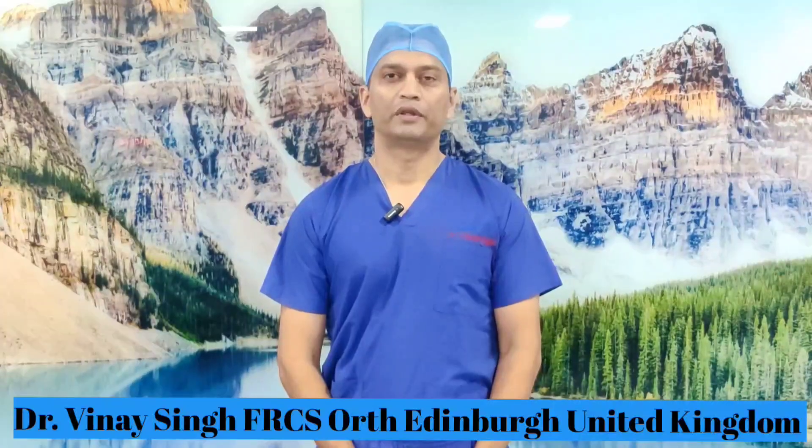Hello guys, today I am going to demonstrate how to reduce this difficult distal radius fracture which I call a pronator type fracture of distal radius in skeletally immature patients. There are occasions where pronator quadratus can be interposed and it can be quite challenging to reduce, and sometimes it may require open reduction. I hope that today we do not have to open it, and I will show you how I reduce them and if I decide to fix with K wire, I will show you how to do that as well.